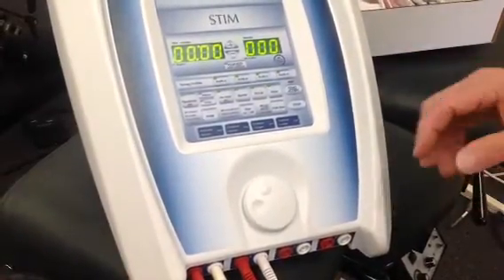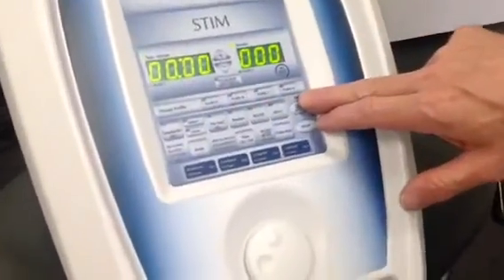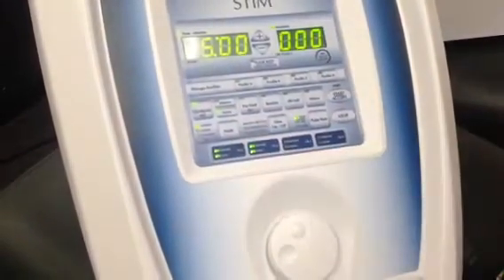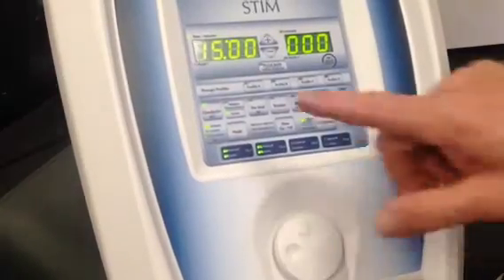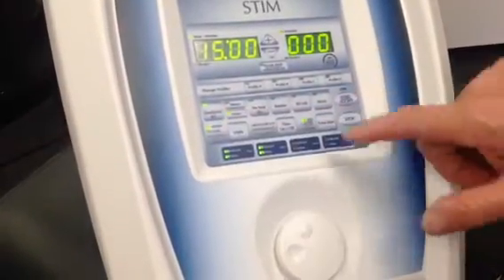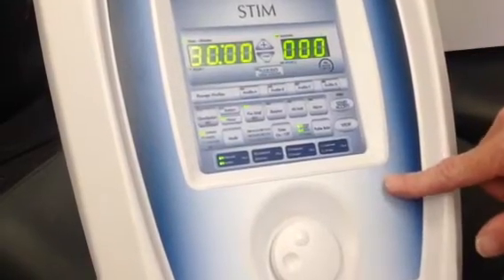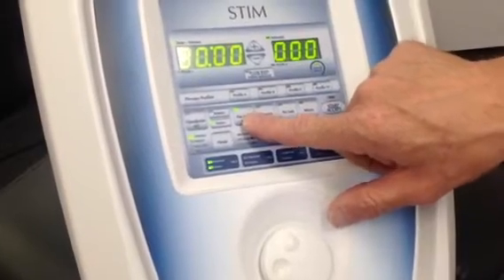Okay, I'm going to take you through the buttons very quickly. Your profiles are your 4 presets, A, B, C, and D. Your quadrupolar is 4 quad, 4 pad interferential. It's the most popular. Then your pre-mod is pre-mixed or pre-modulated in the machine. And that, for the most part, is a 2-channel interferential.